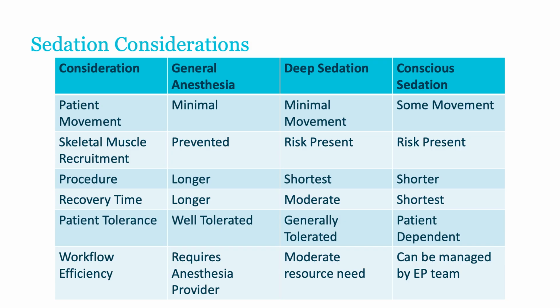However, the procedures are typically longer and you require an anesthesiology team. If you perform the procedure in conscious sedation, the patient may move a little bit more and you have the risk of skeletal muscle recruitment. But the main advantage is a faster procedure that can be managed with the EP team without any additional support.